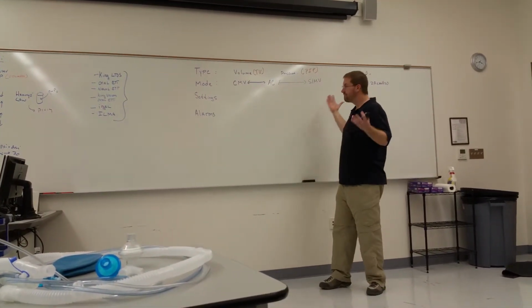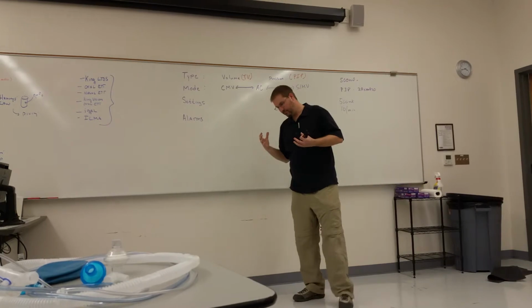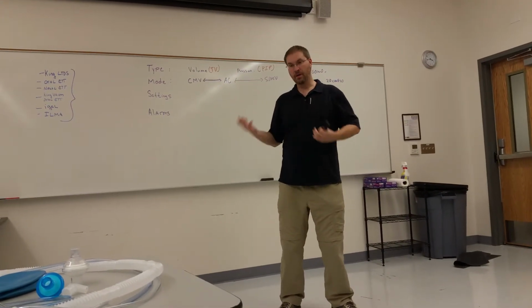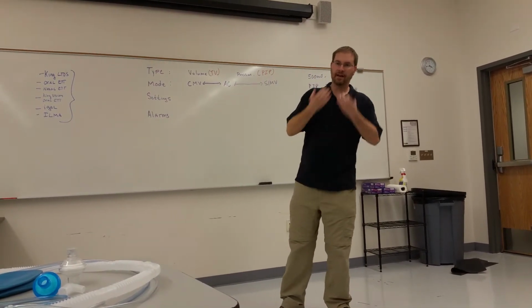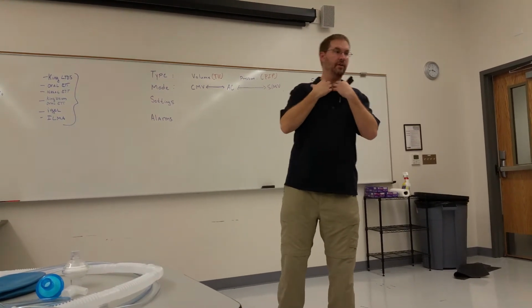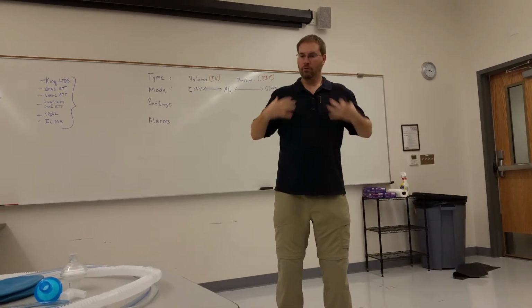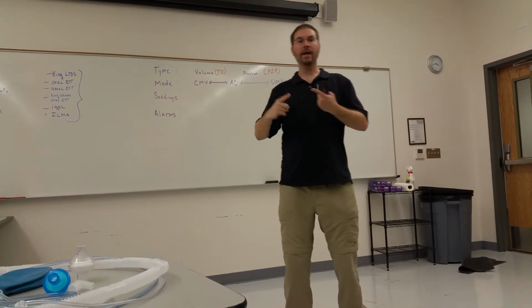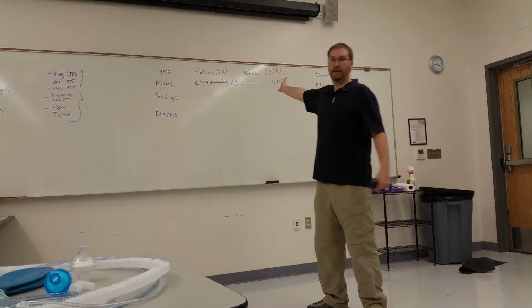I'd say AC. Depends. Completely. If you have a patient that does not have an underlying respiratory problem, they have healthy lungs, SIMV might be a decent mode for them, right? Because they're not in any distress, they're not having difficulty breathing. Like, let's say somebody had a burned airway. Okay, they have an inhalation injury, their airway's burned, and you intubated them because you were afraid of their airway closing up. Well, are their lungs necessarily damaged? No. Is their brain damaged? No. So they may be awake, they may be alert, they may be taking spontaneous breaths. They're probably going to be more comfortable in a mode like SIMV.